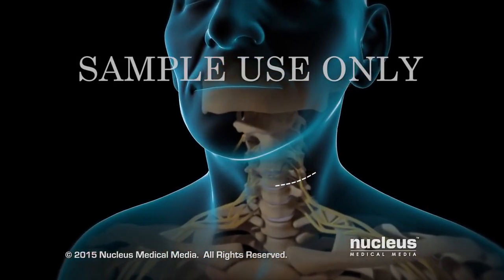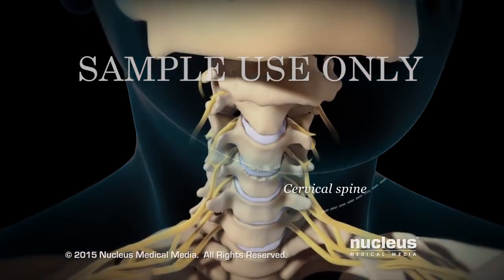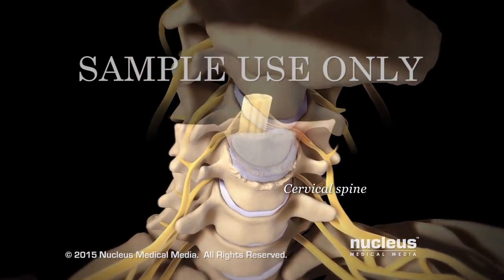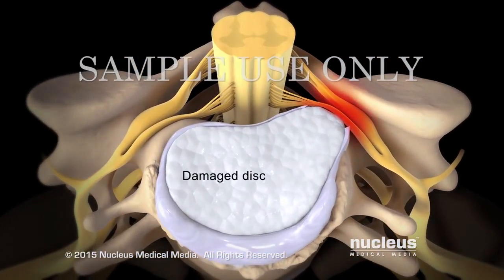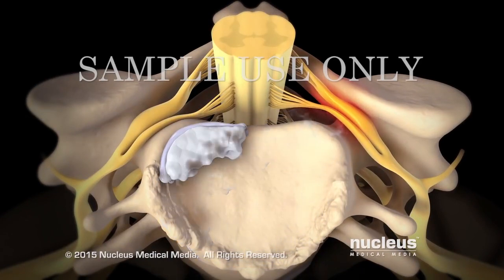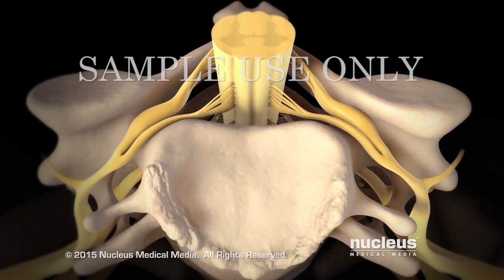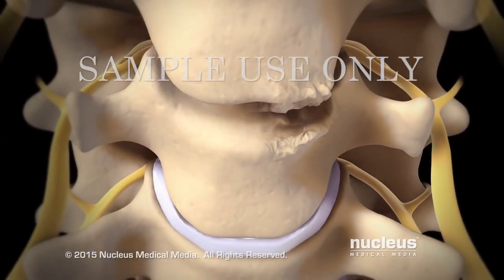Your surgeon will make an incision on your neck. The front of your cervical spine containing the damaged disc will be exposed. Your surgeon will remove the entire damaged disc. This helps relieve the pressure on your spinal cord and nerve roots. Then your surgeon will remove any bone spurs.